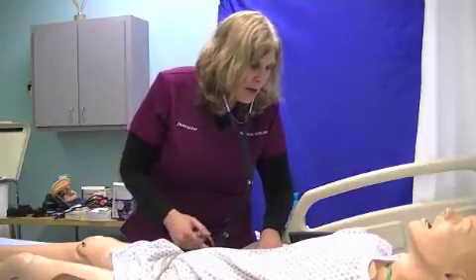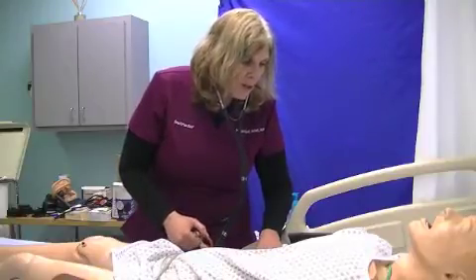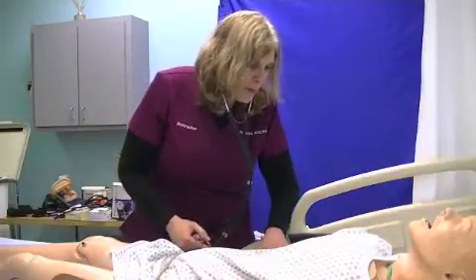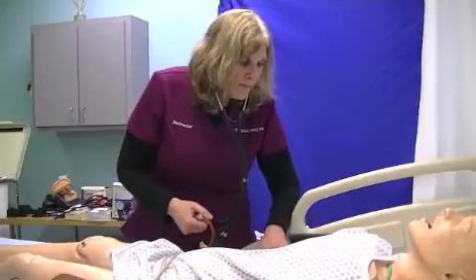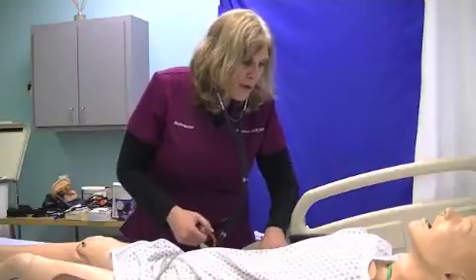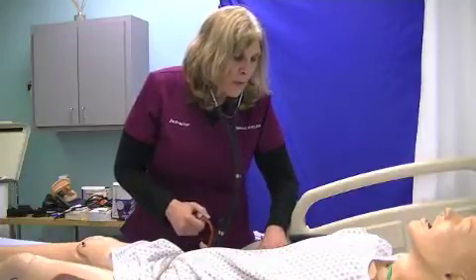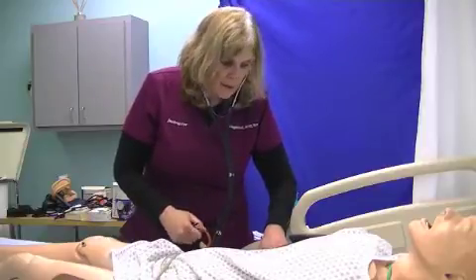Each little line on here, there are lines by tens, and each little line is 2 millimeters of mercury. So I don't want to see a 123/75, because each line is 2 millimeters of mercury. So I'm going to pump till I get to 80, and keep going up until I no longer feel the pulse, by 10 millimeters of mercury at a time. When I no longer feel the pulse, I'm going to stop, and I'm going to pump the blood pressure cuff 30 millimeters of mercury above, so I don't miss hearing the sounds.